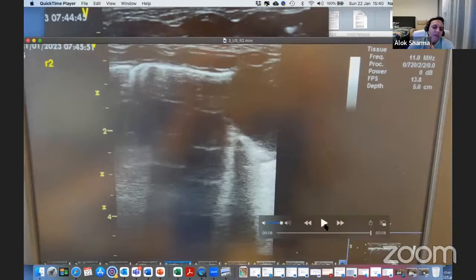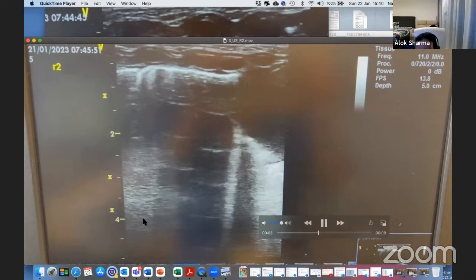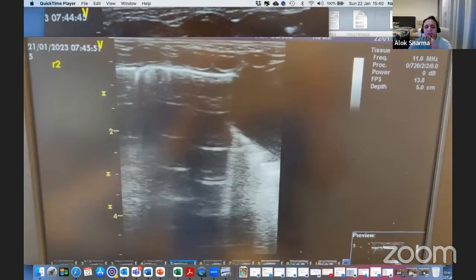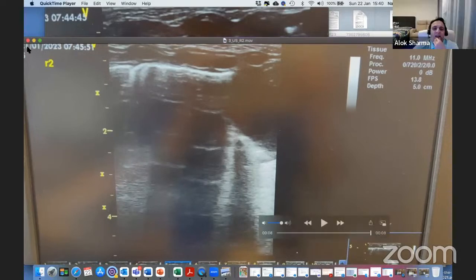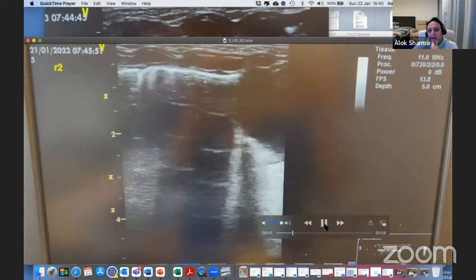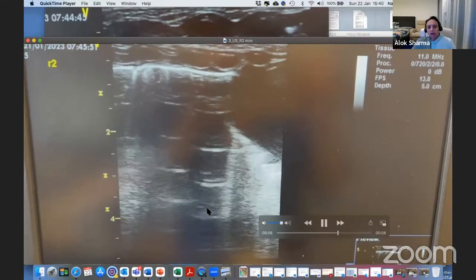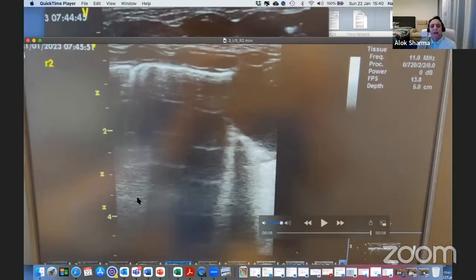And it's just reflective of an area of lung that's not been recruited. Do we know what the CRP on this baby was? Less than five. The first one, sure. For me, the pleural line looks pretty smooth over here. This is a dominant A profile. So you recruited a lot of the lung, but you've definitely got an area of consolidation at that portion below, which is deep consolidation. It's not superficial consolidation.